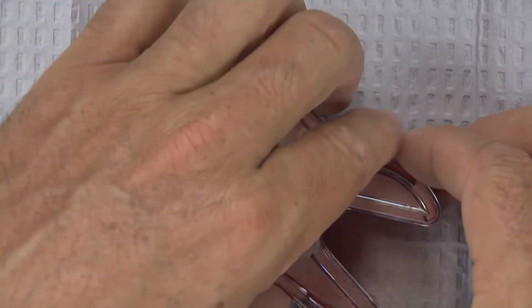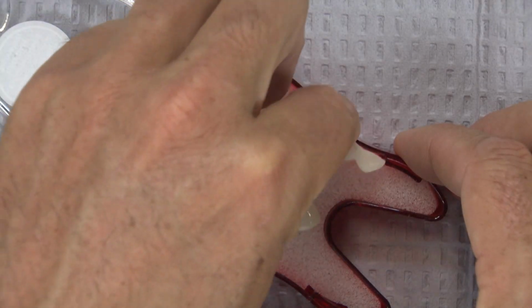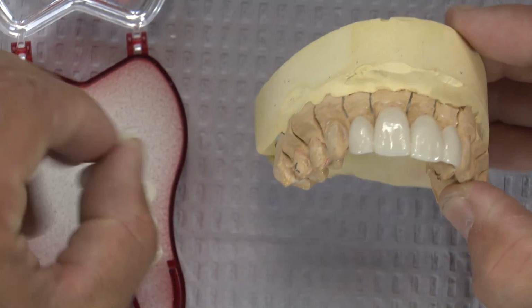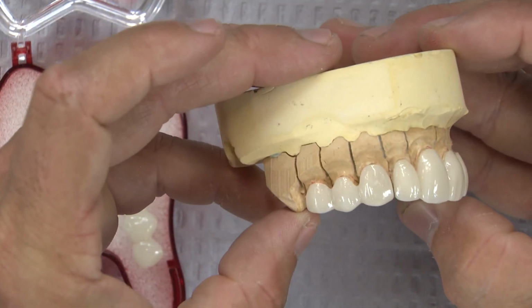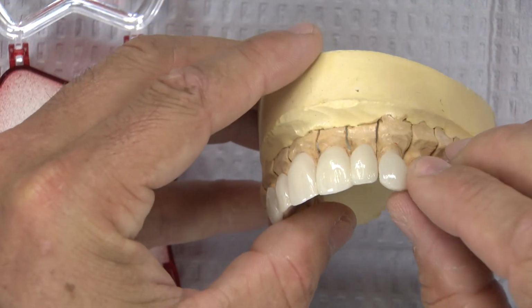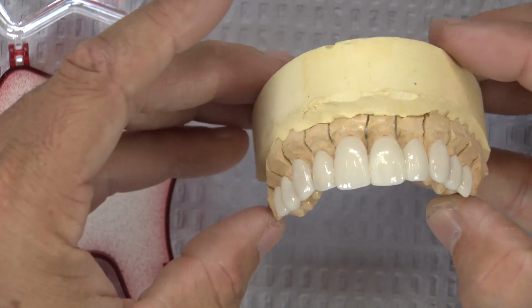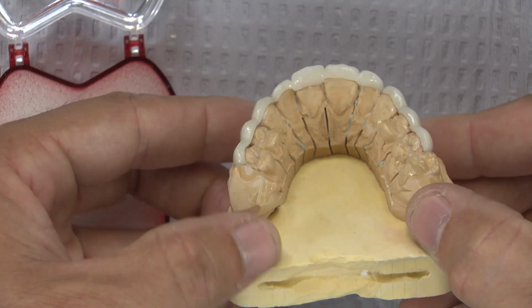Another option for larger cases, and I'm talking about cases of 8 to 10 units or more, could be to order the biotemps in segments as anterior and then posterior left and right splinted units. This is especially helpful for large veneer cases where the mesial and distal reduction is minimal and interference may occur. If a series of prep dates is scheduled, this segmented approach allows me to place the biotemps accordingly instead of having to separate a large roundhouse biotemp chairside.